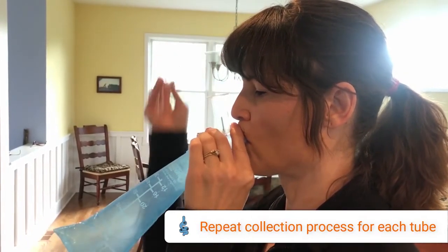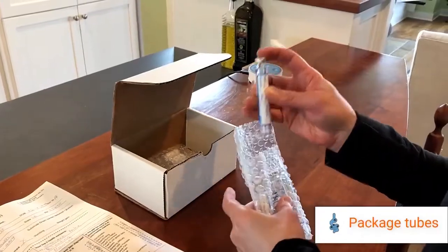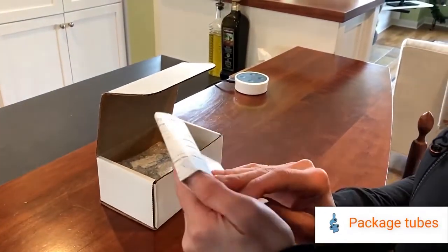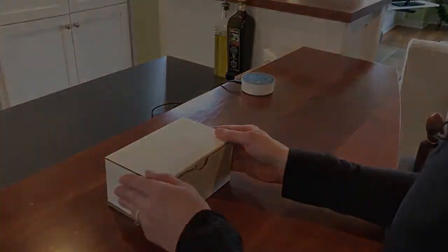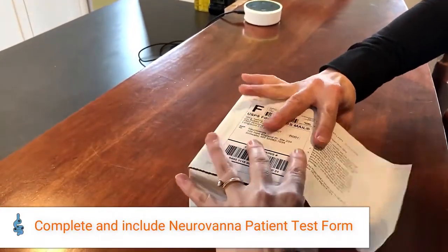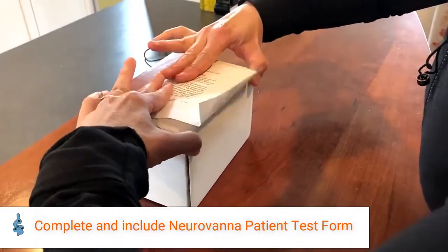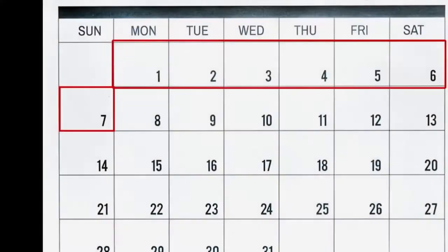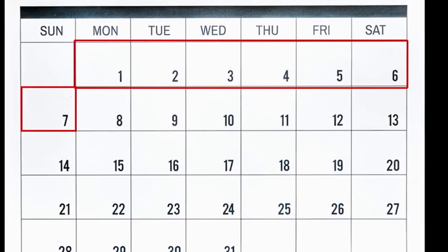Upon completion of the test, protect the collection tubes by putting them in bubble wrap envelopes. Place the protected tubes and your completed patient form back into the collection box and close the box with the shipping label. Tests must be mailed back to Neurovana within 7 days of testing.